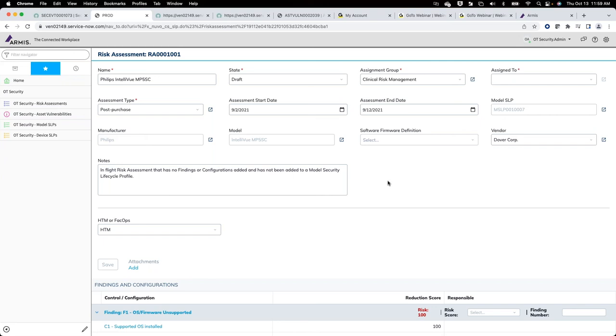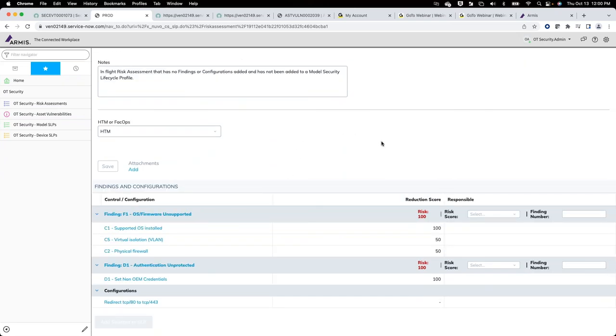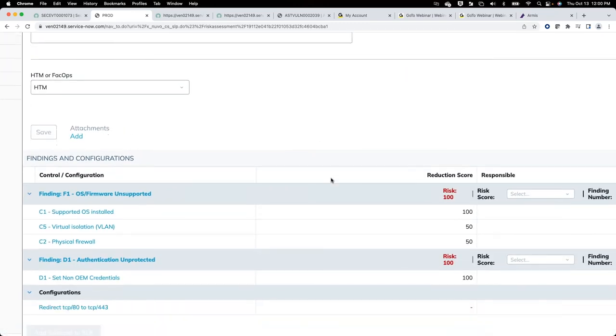We always tend to go to preventative or remediation where I just patch it and I'm done. We're not always afforded that luxury. So now we start getting into risk management. And that's where what Dustin was showing can help me: okay, it started with a handful of devices, it's quadrupled. I need to go back and reassess the risk and present that up to the organization so they understand what you signed up for.